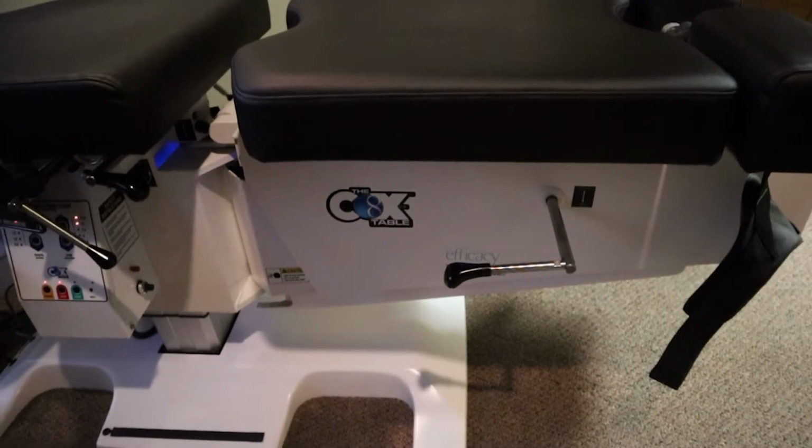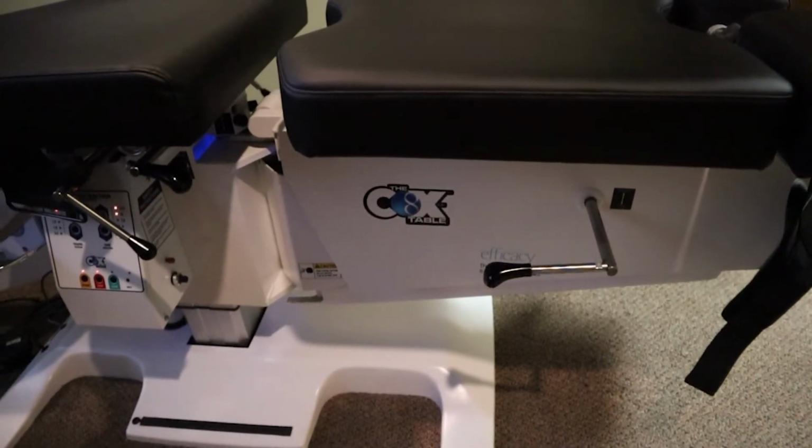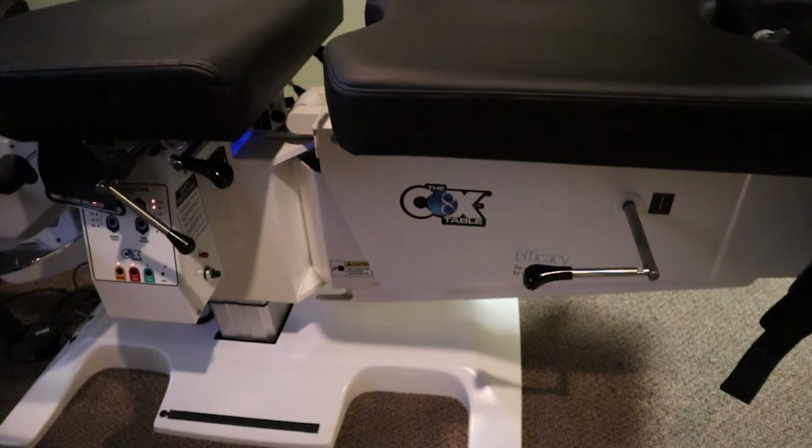Dr. Cox coined the term flexion distraction in 1973. He is the founder of the technique and developer of the first flexion distraction table. He has been instrumental in the design and development of the modern tables we use today. Flexion distraction tables are not all created equal. He has continued to innovate these instruments as research has expanded our knowledge and understanding. Only certain manufacturers have been able to carry the name Cox on them. As of today, the Cox-8 force table is the latest and most advanced model produced.